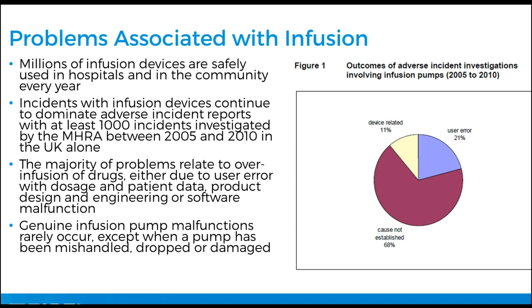There's a lot of different aspects that can go wrong with using an infusion device. The breakdown there has 11% that were device related, 21% user error, and then a big slice of that where the cause just can't be established. Genuine infusion pump malfunctions are typically rare, except when a pump has been mishandled, dropped, or damaged.